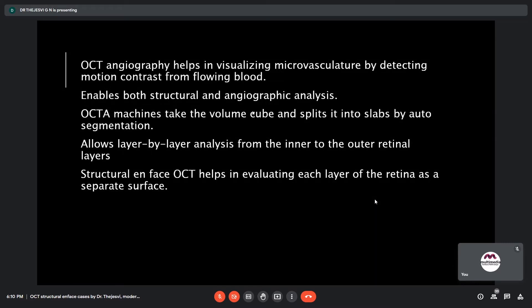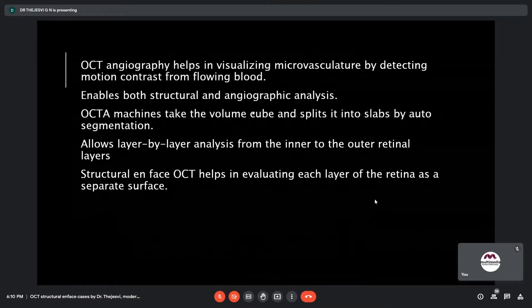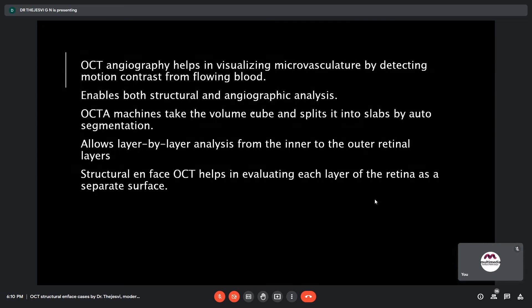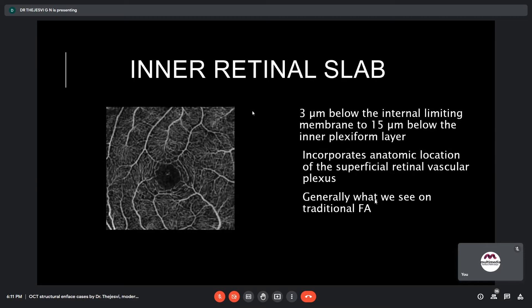OCT angiography helps in visualizing microvasculature by detecting motion contrast from flowing blood. It enables both structural and angiographic analysis. OCTA machines take a volume cube and split it into slabs by auto-segmentation, allowing layer-by-layer analysis from the inner to the outer retinal layers. Structural en-face OCT helps in evaluating each layer of the retina as a separate surface, and the auto-segmentation used in angiographic analysis also helps in structural imaging in OCTA.